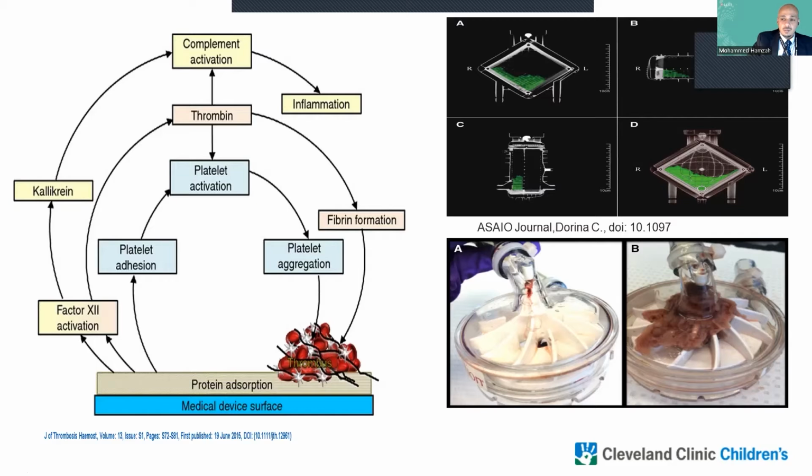A study was done using multi-detector computed tomography with 3-dimensional post-processing to quantify the thrombus burden in the membrane oxygenator. And you can see here, there's thrombus formation in the membrane oxygenator that can be detected using this technology.